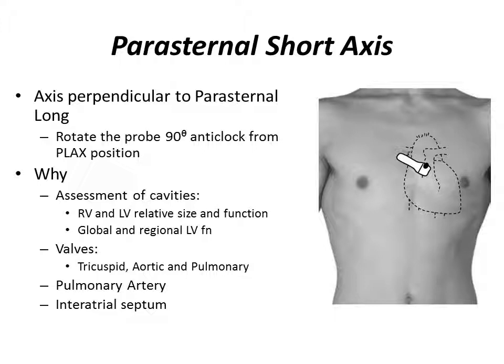You're able to also see the pulmonary artery, which is difficult to see otherwise, and sorry, it's difficult to see in this view as well, but if you can, then it gives you a good assessment of the pulmonary artery. It can give you an idea of what the pulmonary pressures are. It can give you an idea of what the pulmonary artery size is.